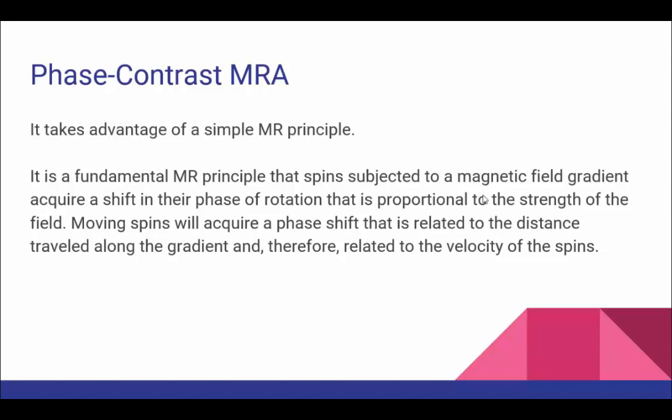Now I'm going to be talking about some types of MR angiography. Let's start with the definition of phase contrast MRA. Phase contrast angiography relies on dephasing the moving spins submitted to a bipolar gradient. For a bipolar gradient of a given intensity and time, the moving spins will dephase in proportion to their velocity. Phase contrast MRA is similar to conventional X-ray angiography in that both methods employ subtraction to eliminate signals from stationary tissues. As a result, only signals from flowing blood are present in the angiogram.